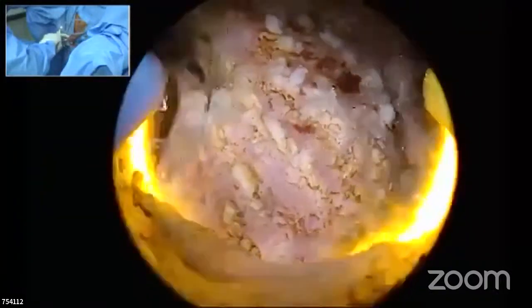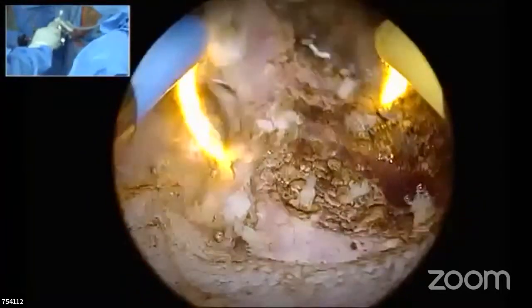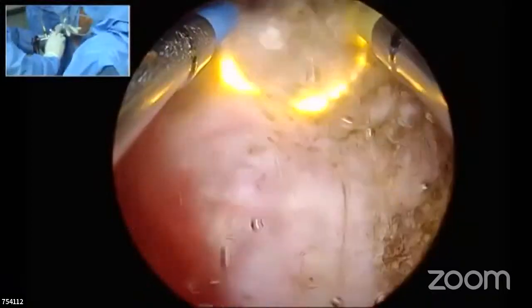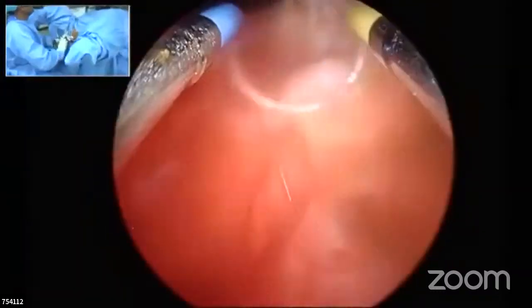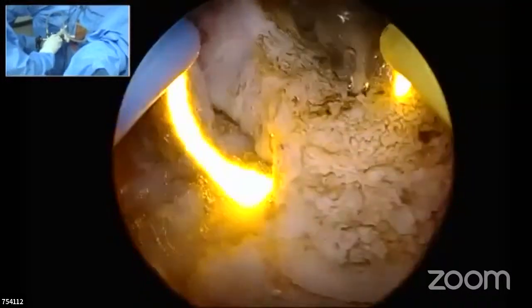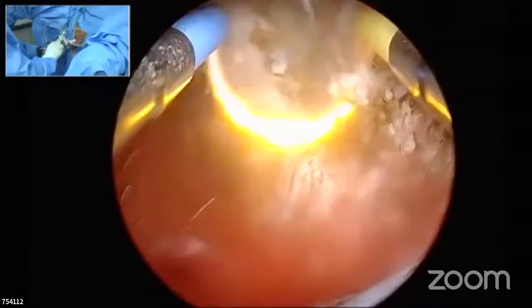Very slowly, the hemostatic effect will be very nice. You don't need to go back and fulgurate the bleeders there again. I'm doing it very slowly. You can see the difference completely. Absolutely correct. And you are coagulating the bleeders again and again because you are not using the Iglesias equipment. Yes. And every time you empty it, you've got to go back and coagulate some more bleeders.